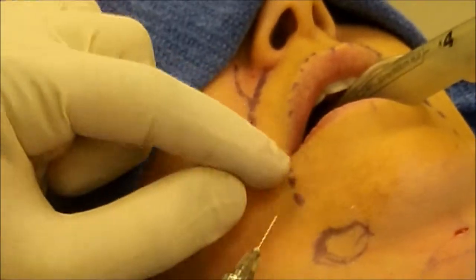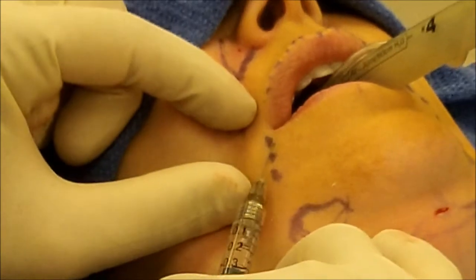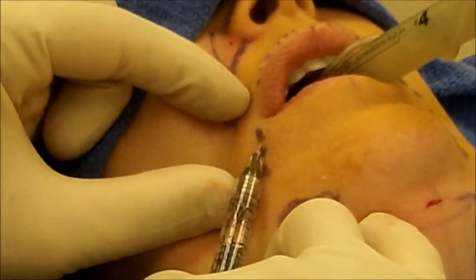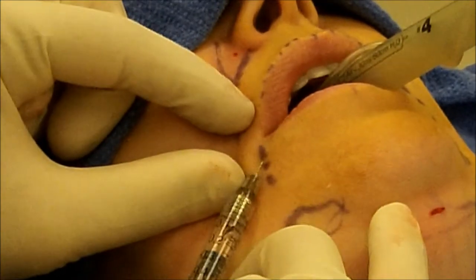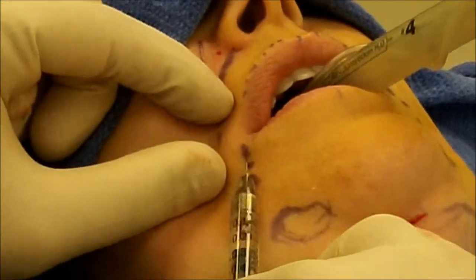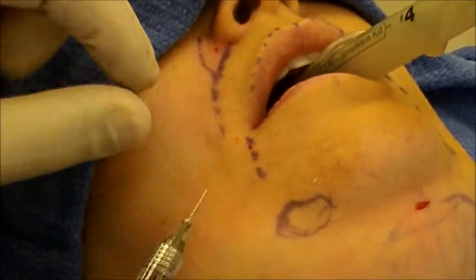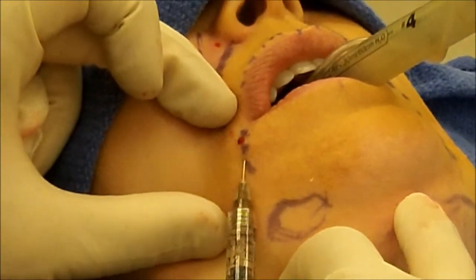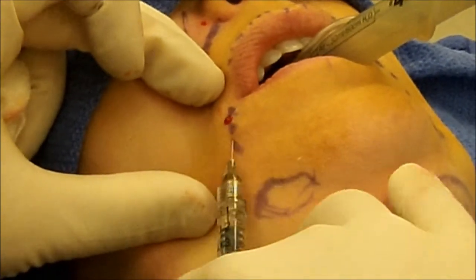Just stretching it out. Same thing with the marionette lines — the corners of the mouth — where we want to turn up the corners of the mouth a little bit. Small injections right at the corners of the mouth to fill the lips a little on the corners and help turn the lips up. You have to give a good amount of support here so the lips turn out. A little bit on the sides and then a little more in the marionette fold to fill those lines along the bottom of the mouth.